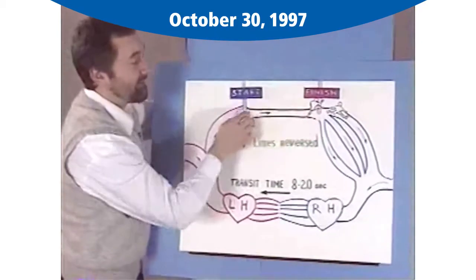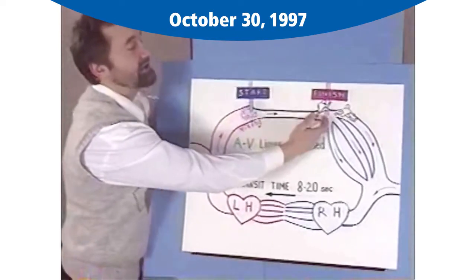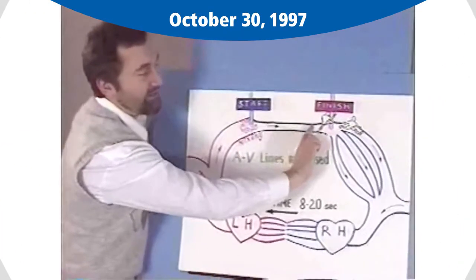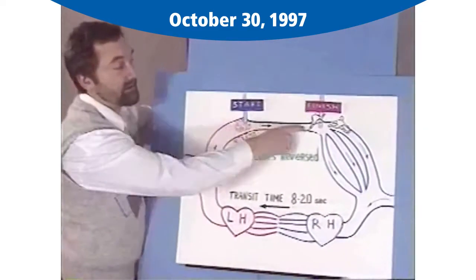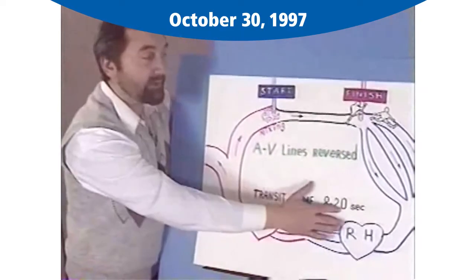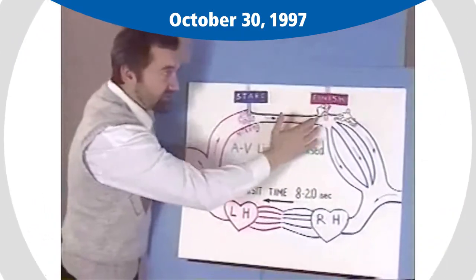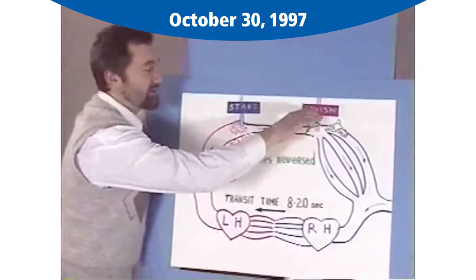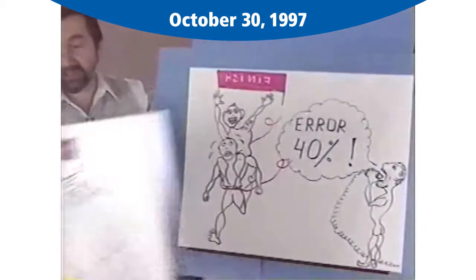So when we make an indicator injection, it's mixed here, comes through the vascular access, and part of it is withdrawn by the arterial line. But as before, another part of the indicator will travel through the cardiopulmonary system and come back here. And as you see, the travel time is pretty quick. So what happens if the artificially created circulation is still going on, and this second part of the indicator arrives during this time, for example, because the injection is too long? In this situation, what can happen?